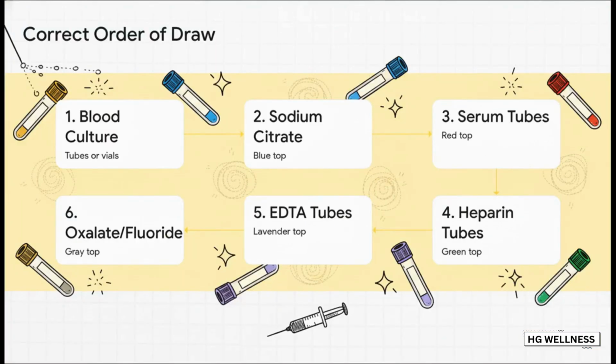Now, let's talk sequence. This is the standardized order of draw. This protocol was designed for one crucial reason, to prevent the additives from one tube from contaminating the next. Every time you switch tubes, the needle can carry microscopic droplets from one stopper to the next. This order is specifically designed to minimize any interference.